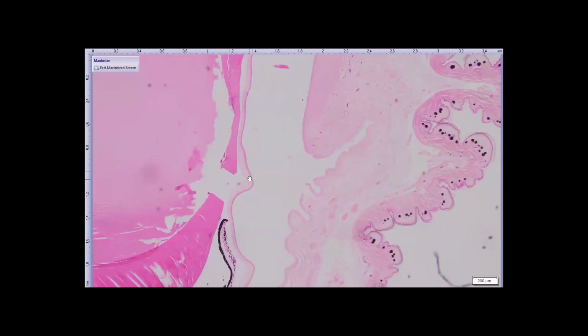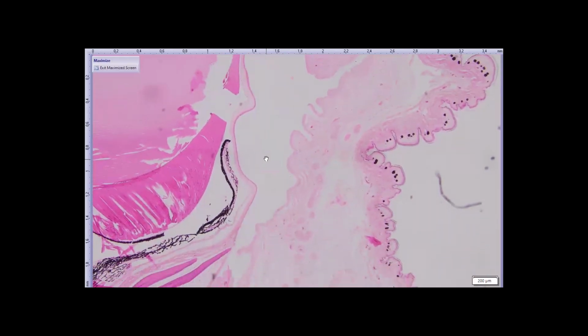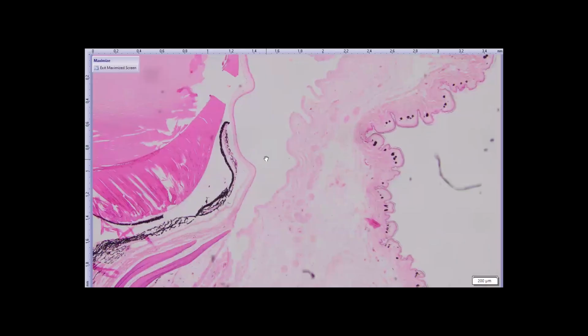And I think that explains to some extent why it's capable of achieving a dramatic axial curvature. You can't tell on this histo slide. I wish there was a way, either in the gross eye removed from the head or on histology, to calculate what the corneal curvature is, but it's hopeless. But I think this very thin cornea will allow that cornea to achieve a remarkable axial curvature.